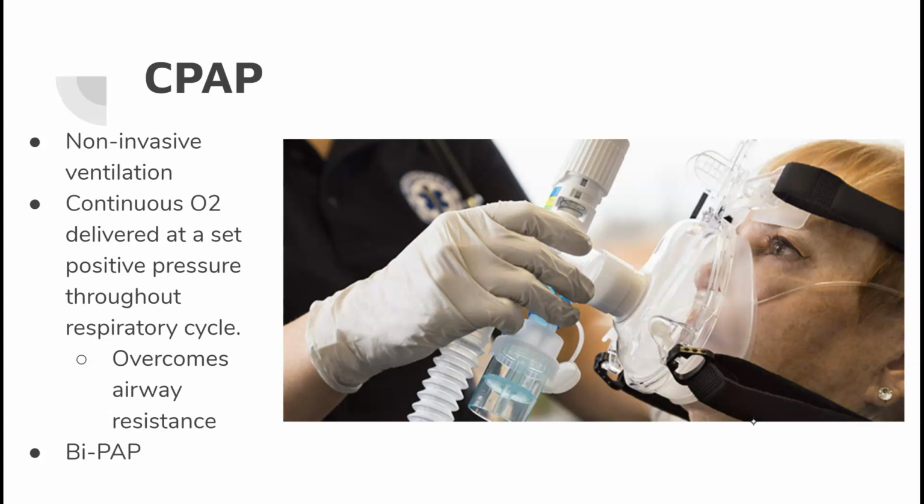Where would you put the side stream in something like this? The side stream would go in their nasal, like the nasal cannula setup. So the side stream is what she has, yes, the inline.